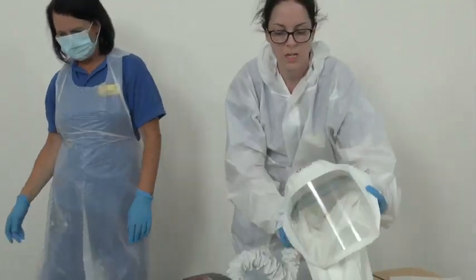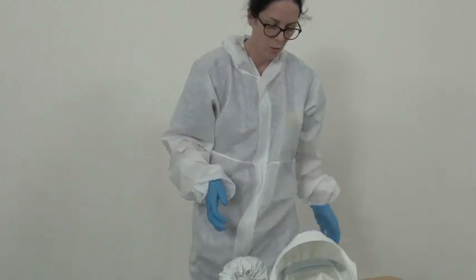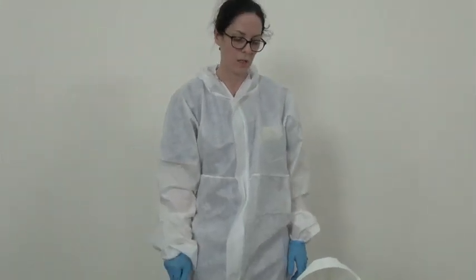Clean waist belt, hood and hose as per instructions and send to CSSD. Thank you.